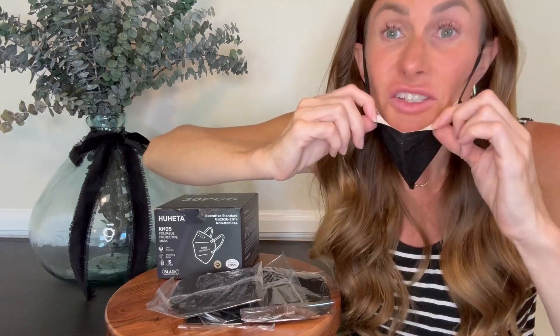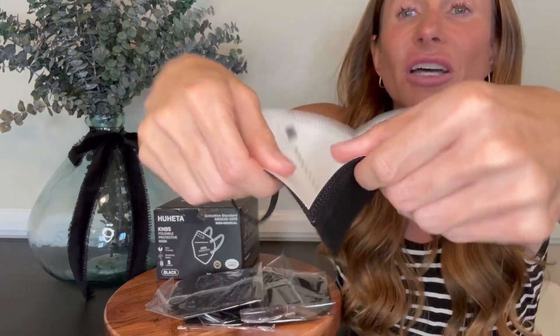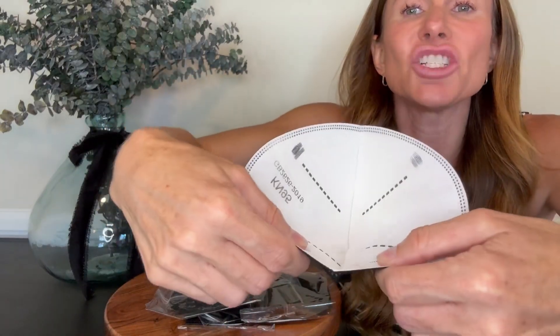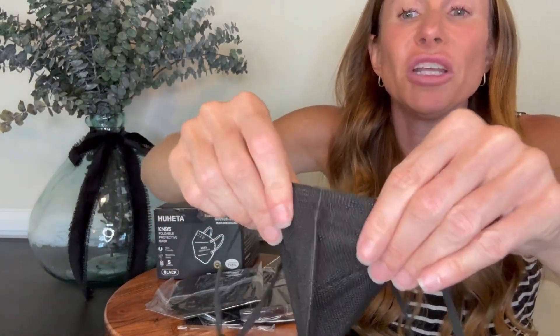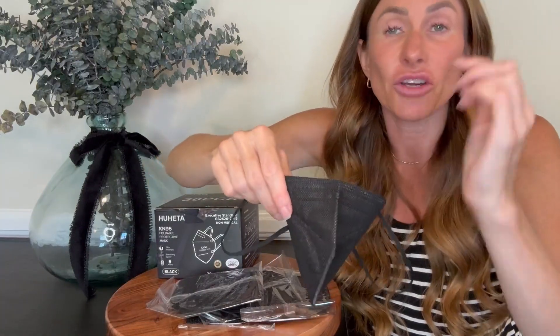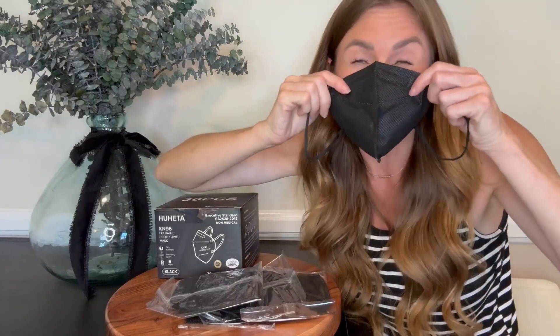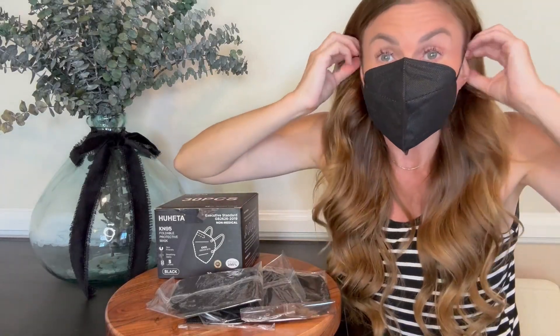You also have a metal nose piece here on top, and it is adjustable so you can, once you put it on, bend it so that it shapes across the bridge of your nose, creating a secure fit there so that you don't have any gaps.